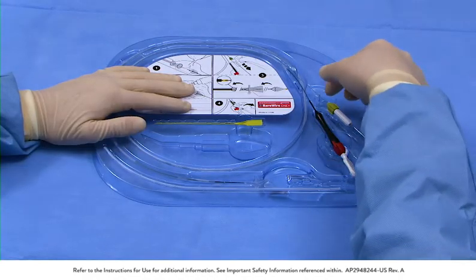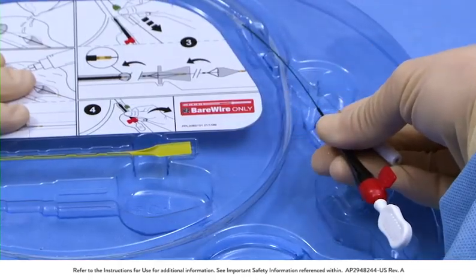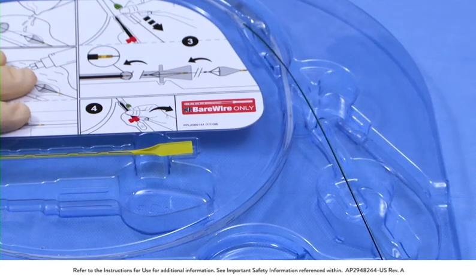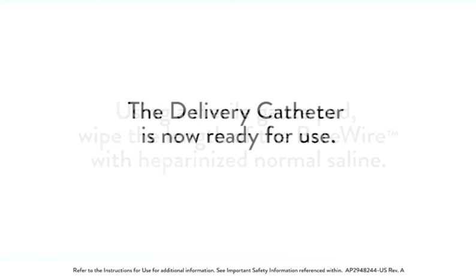Grip the black handle on the delivery catheter and the torque device out of the tray together. Gently pull them together to remove the loaded delivery catheter and the bare wire from the tray. Using a sterile gauze pad, wipe the length of the bare wire with heparinized normal saline. The delivery catheter is now ready for use.